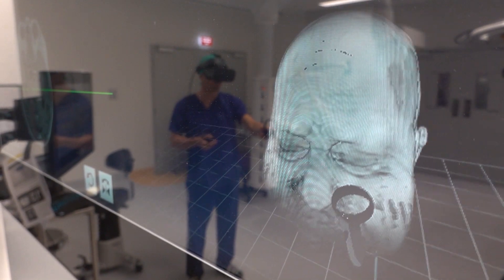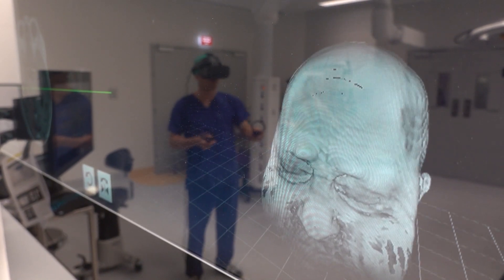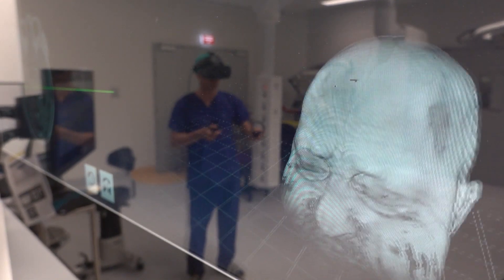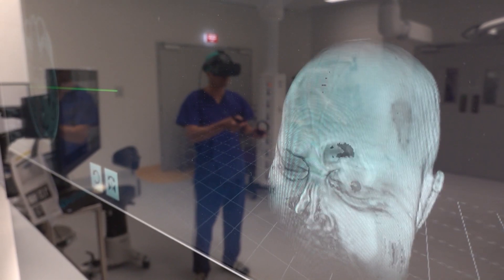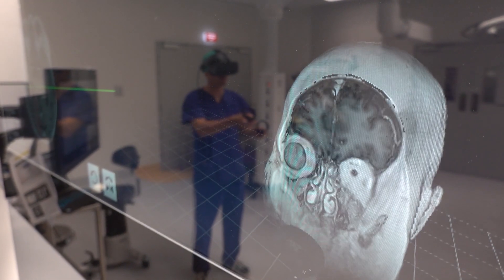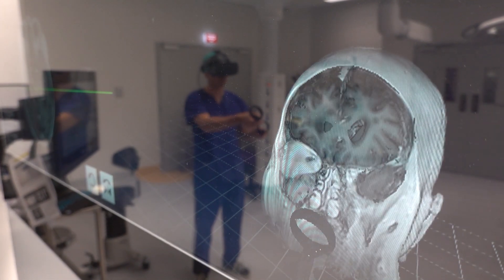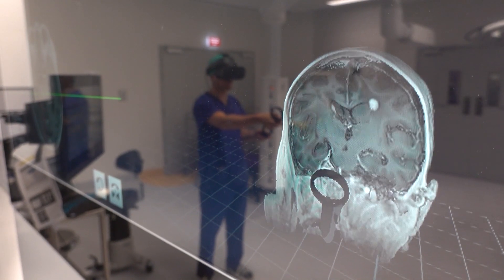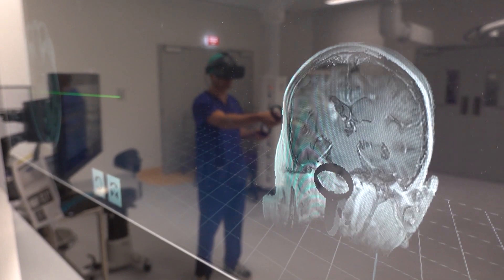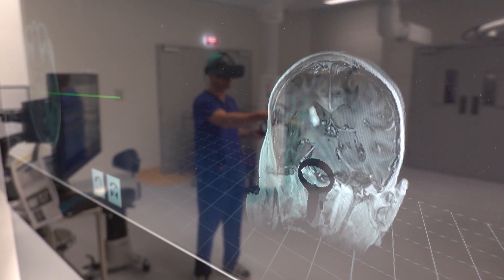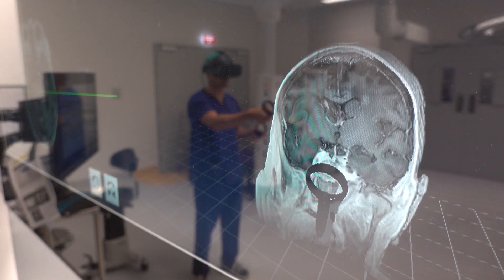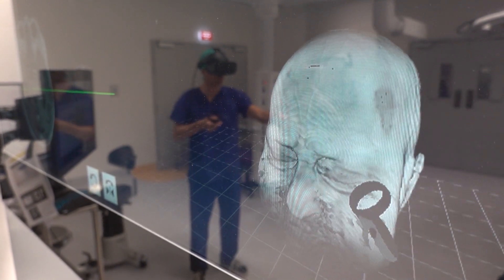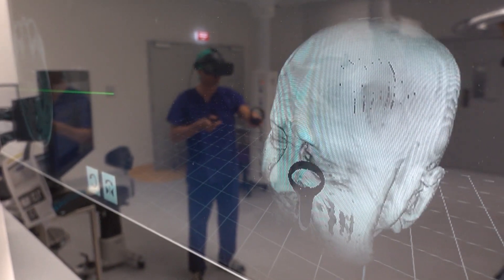With the insert set tool I can go through the brain and look at the lesions. With the other tool I can turn the head of the patient in any direction and in that way go through the brain and see particular structures like vessels.